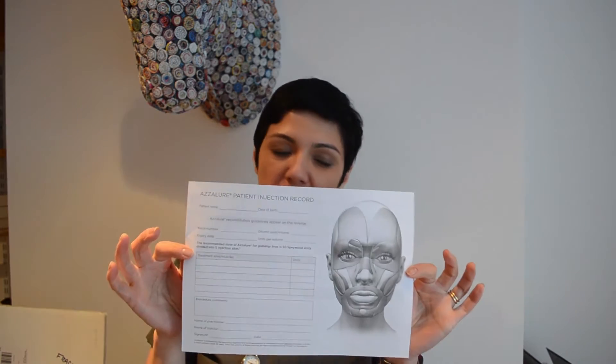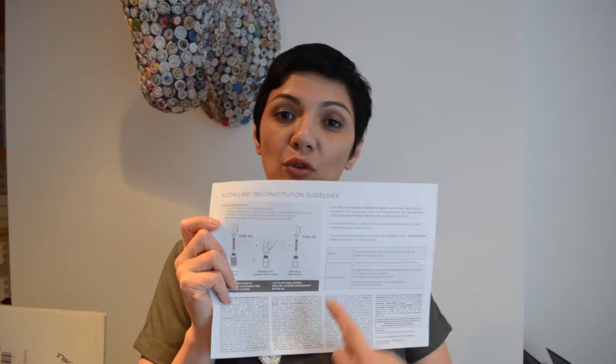So what you get in your pre-injection training pack is you'll have two of these. These are your injection record sheets. So you can see here is reconstitute with 0.63 ml.